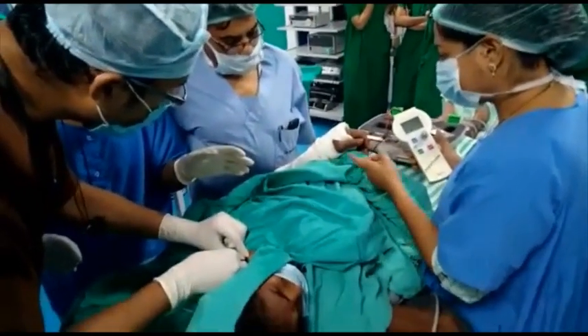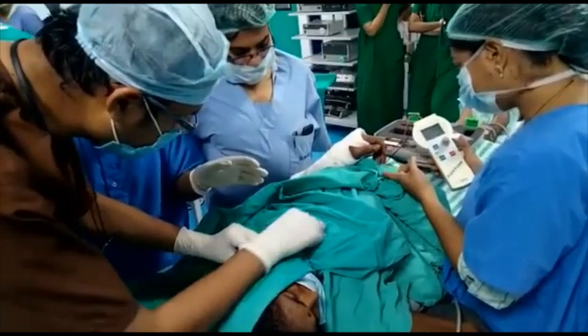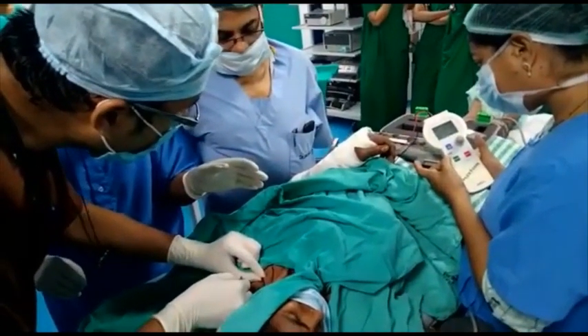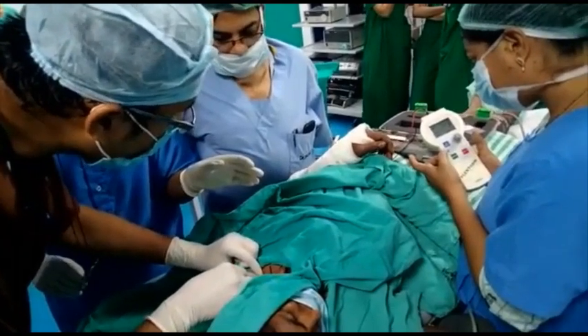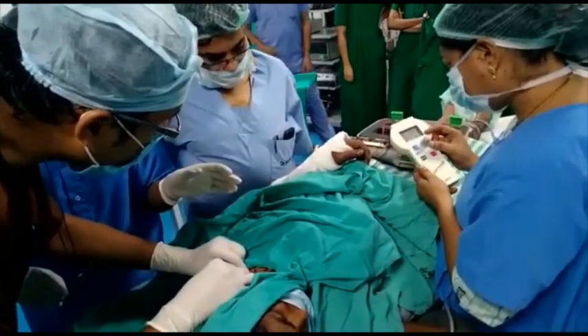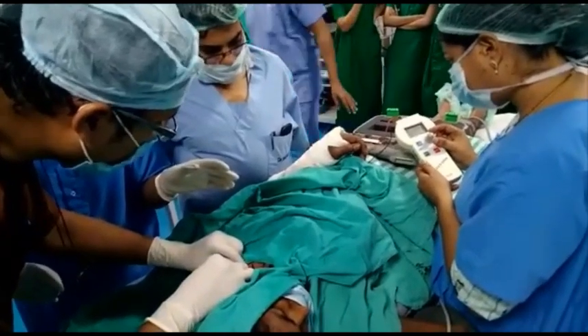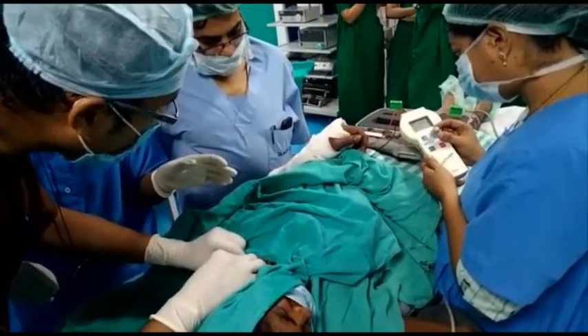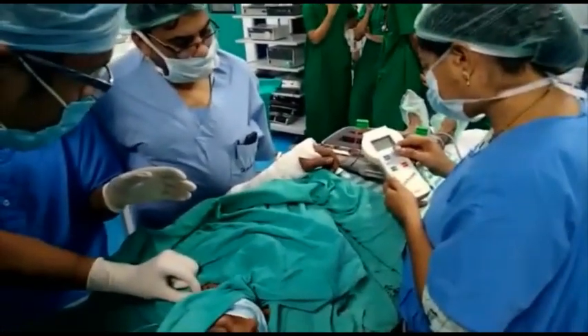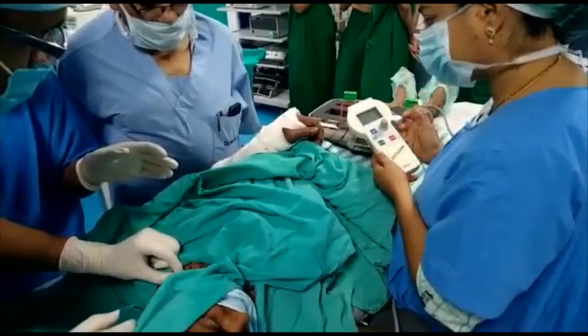Now we have to insert the needle posterolateral to the subclavian artery and direct it in a caudal, medial, and posterior direction. We have to seek for the twitches of the fingers. Initially we started with a current of 1 milliampere, and we have to decrease it gradually. At 1 milliampere we have got the twitches.